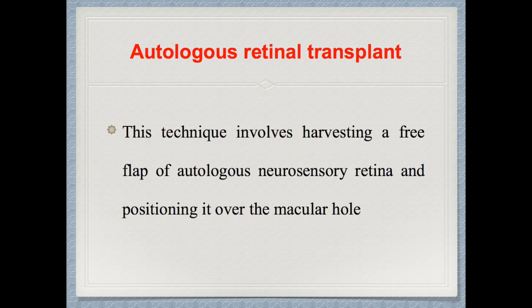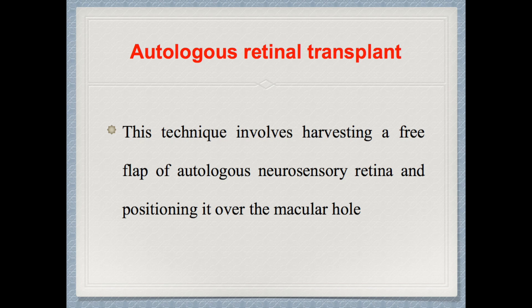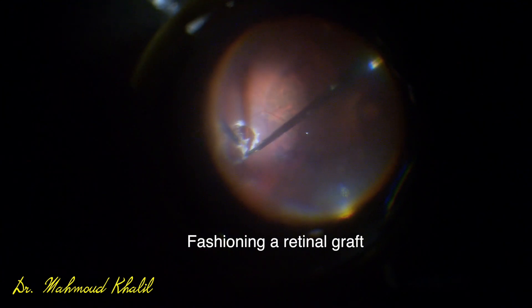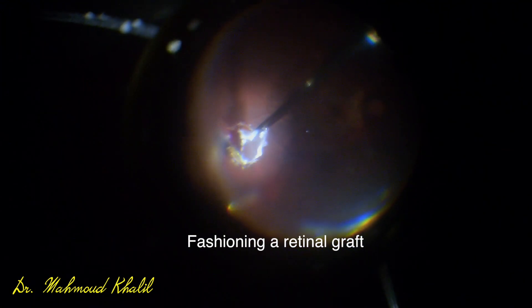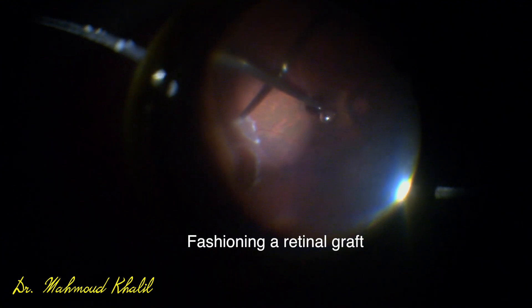The fourth technique, which has added great benefit in primary and refractory macular holes, is autologous retinal transplant. This technique involves harvesting a free flap of autologous neurosensory retina and positioning it over the macular hole. As seen in this video with a macular hole with retinal detachment, starting to fashion the retinal graft with light diathermy, then using both hands to fashion the graft. Before cutting the retinal graft, increasing the peripheral PFCL to the site of the graft, then sliding the retinal graft on the surface of the retina until it covers the macular hole.